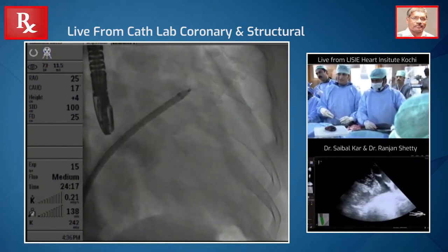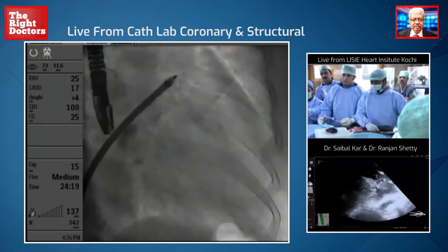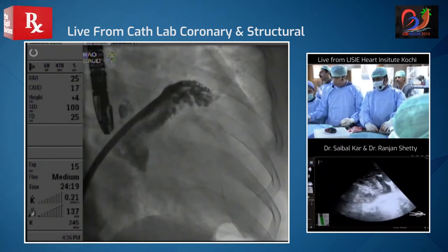You can see the trabeculations — I want to show the audience where we measure. Let's take a picture here. So you can see we are quite deep inside; we need to just cover the trabecular part.